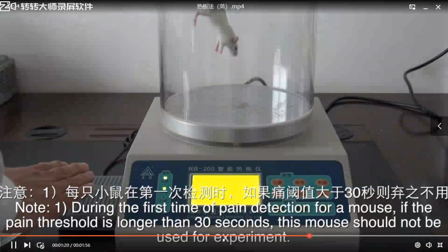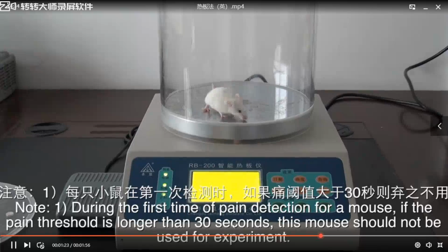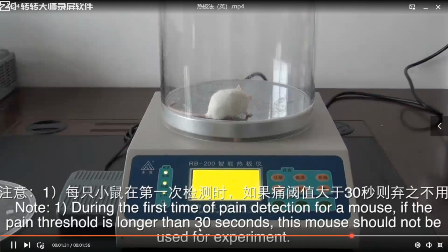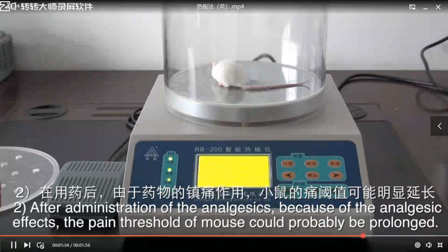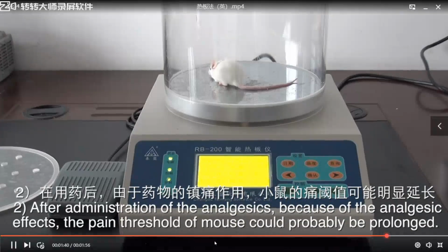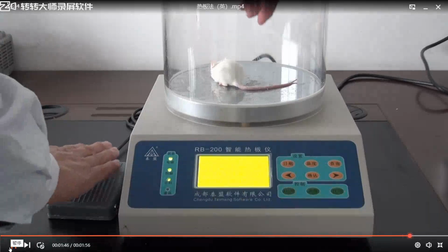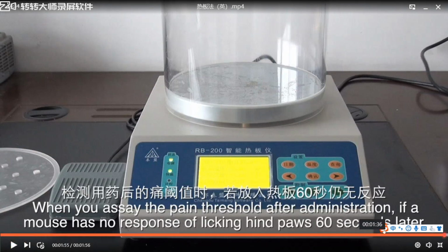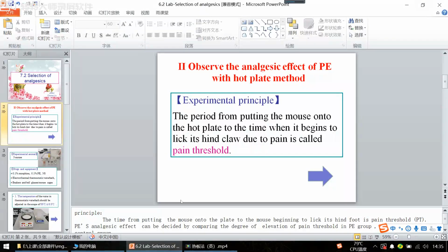Note 1. During the first pain detection for a mouse, if the pain threshold is longer than 30 seconds, this mouse shouldn't be used for the experiment. 2. After administration of the analgesics, because of the analgesic effects, the pain threshold of the mouse could probably be prolonged. When you assess the pain threshold after administration, if a mouse has no response of licking hind paws after 30 seconds, take it away. Okay, let's continue.